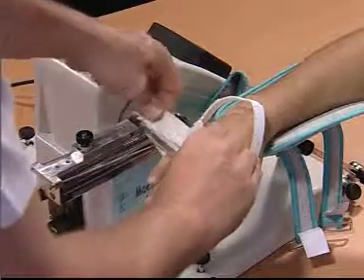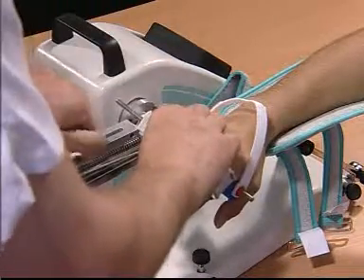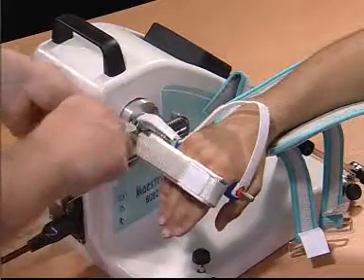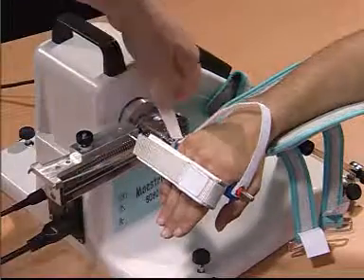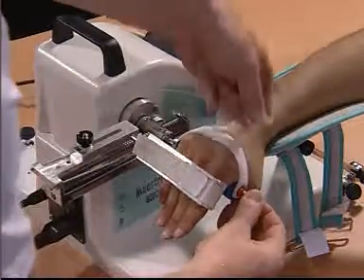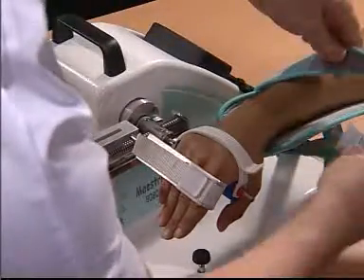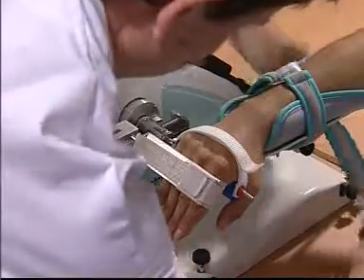We place an attachment over the proximal phalanges of the digits. We secure it to the trainer. And once all straps are secured, we begin the movement.